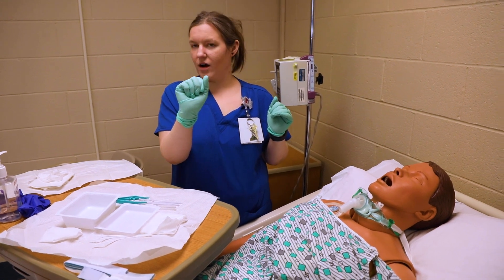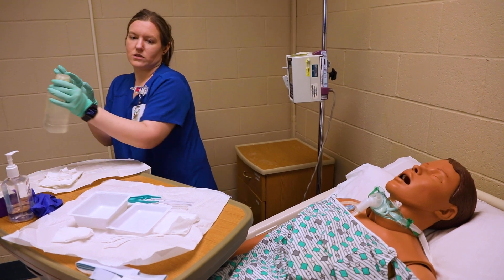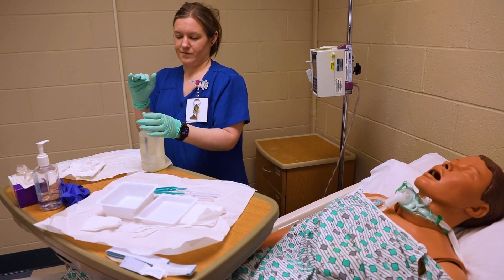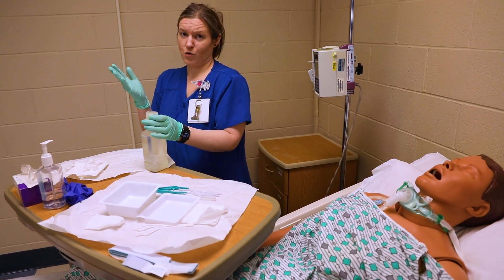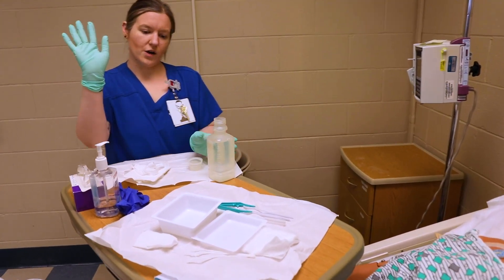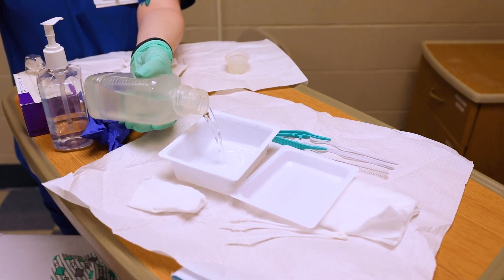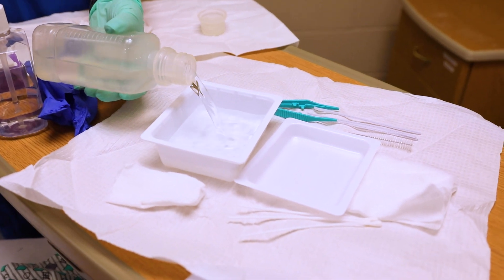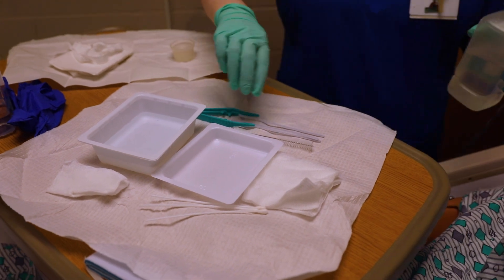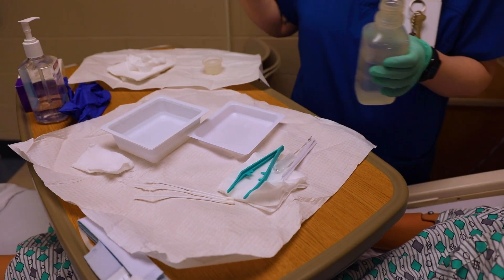Now we're hyperoxygenating our patient. I've got to pick a sterile hand — my sterile hand is going to be the one closest to my supplies. You need to get some sodium chloride, or sterile water, whatever your facility requires. Remember, this hand is sterile, this hand is not. I'm going to walk around so I don't pour over anything, and pour a little of that in there.